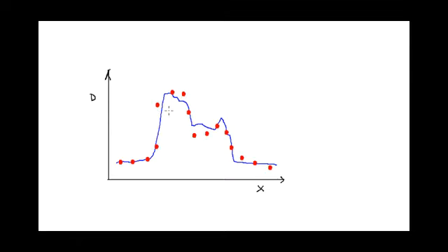So we use a special metric that combines both the deviation in the dose and the deviation in the distance. Let me start by plotting some difference in dose here. Let me say 3% would be the allowed deviation. And then in the other dimension, I'm going to show the allowed deviation in distance, 3 millimeters here. And I can draw a circle that would account for both of these. So let me just shrink this down a bit so it's more realistic, and I can move this to the first measured point. Let's look at this point.